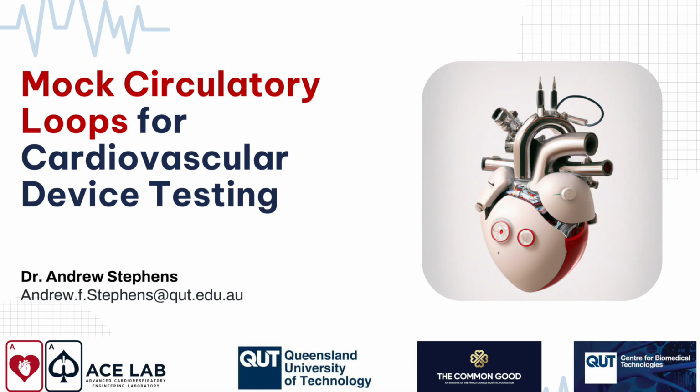So as I said, you can use passive compliance chambers using a trapped volume of air, whereby the amount of air you trap in the chamber, so the height, determines the compliance. You want your compliance to be about 1 to 3 for your aorta, and for your pulmonary artery about 2 to 4. The way you do this is you allow air into the chamber as you fill it, and then you close the chamber to atmosphere, and then the fluid is non-compressible and the air is compressible.